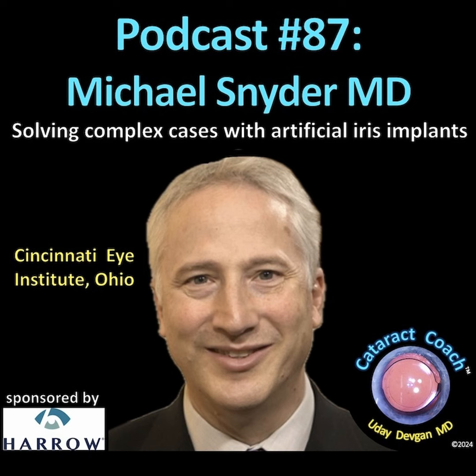If I'm fixing primarily and I'm putting in either a ring or a capsular tension segment, then I'll typically do 180 degrees and dual fixation. If I'm putting in loops around a capsular tension ring, I don't have quite as much control over torque as I do with a primary procedure because the anatomy is not as favorable as I want it to be. And I can't fine tune the centration as well with 2 points as I can with 3. And so it doesn't add a whole lot of time.